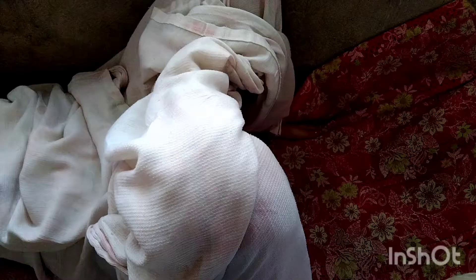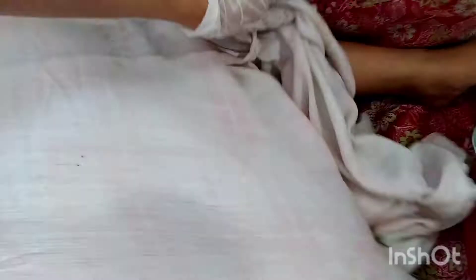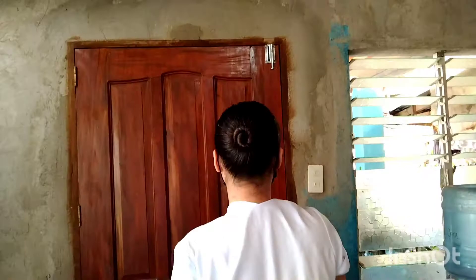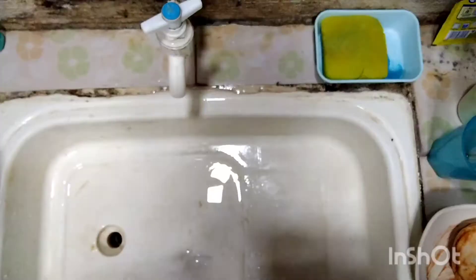After that, the doctor removes the straight single-use catheter slowly. This helps minimize discomfort for the client. After removing the catheter, remove the drapes to prevent transmission of infection. Next, position the patient for comfort and put the bed in the low position with side rails up. This promotes client comfort. After that, discard the equipment in the utility room to prevent transmission of infection. Last but not least, wash hands thoroughly to reduce the spread of infection.